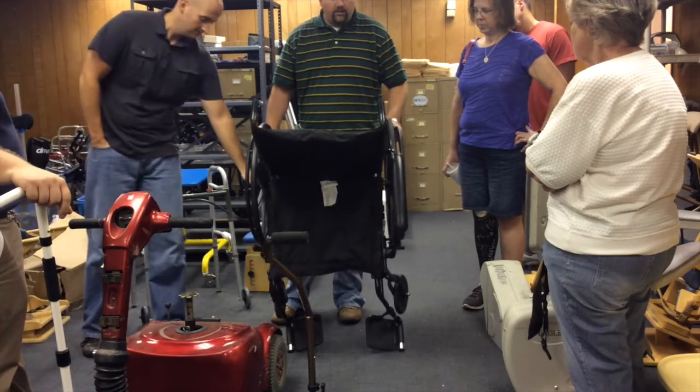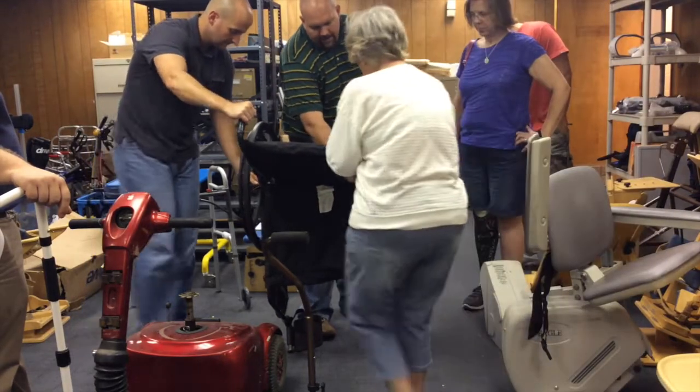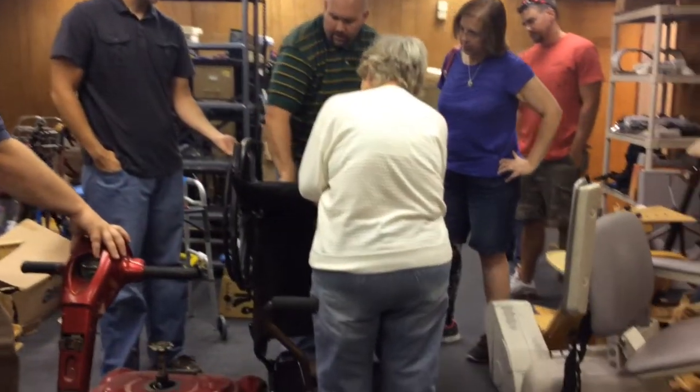Easy way to check your bearings: just grab your wheel, move it side to side, up and down, see if there's any play in it. Neither of these wheels have any play. So I would say these wheels are in good shape. If you want to look a little farther, you can look on the back of the wheel — there's a bearing plate, the shiny silver thing on the back. That's your bearing.